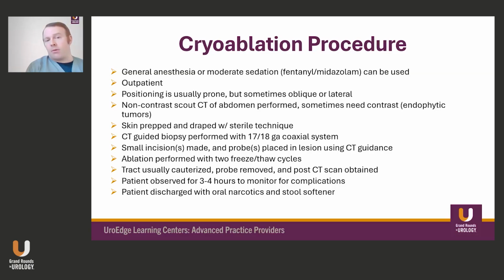So we prep the skin using sterile technique. I always biopsy the mass with the 17-18 coaxial biopsy system if it has not already been biopsied. It doesn't really change the management, but it's nice to get a tissue diagnosis.